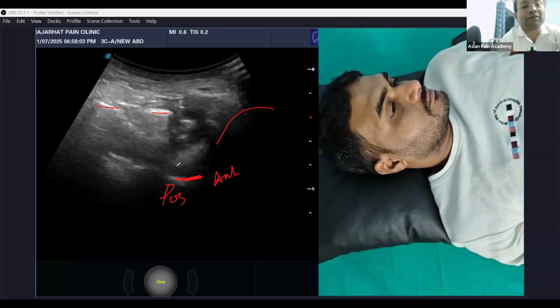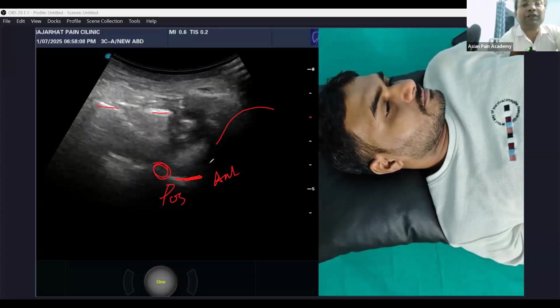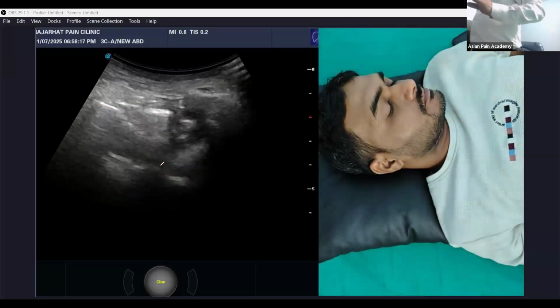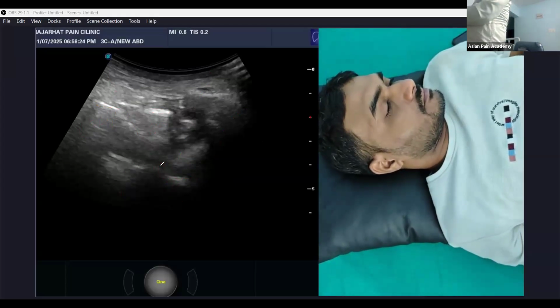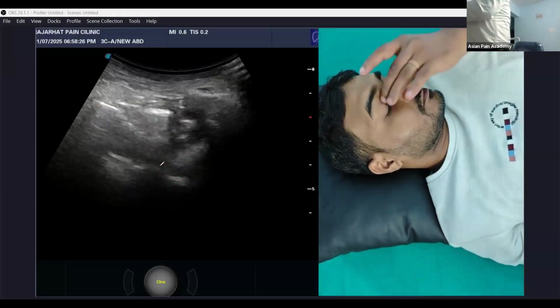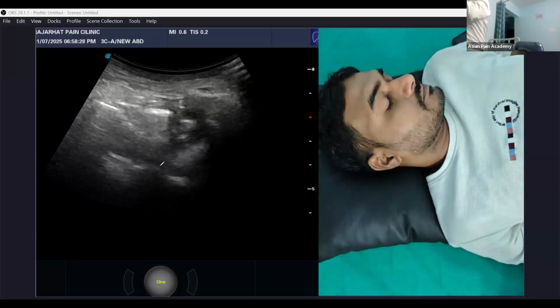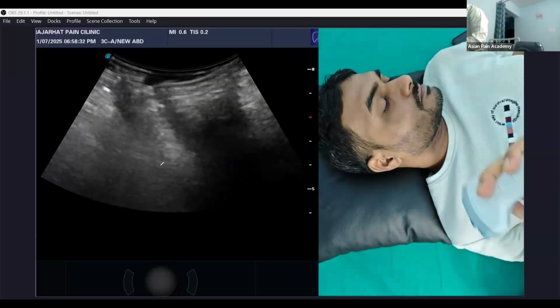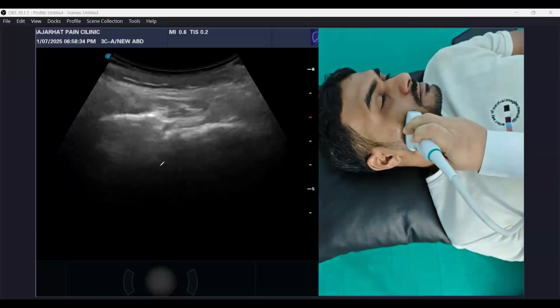Okay, and under ultrasound, only a pulsatile structure we will be able to see here, and if we see very carefully, then here also. These pulsatile structures are nothing but the neurovascular bundle with the maxillary and mandibular branch both. Okay, I show you again. Every time this doesn't take color. So here you see.